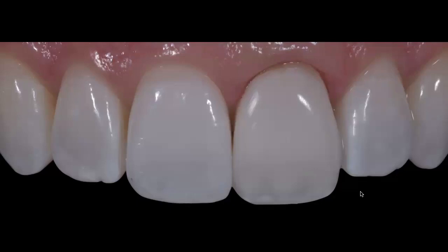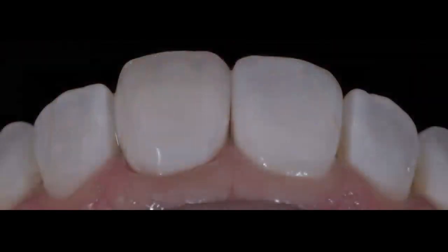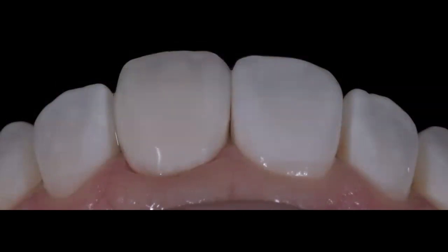This is definitely not the best time for you to evaluate the final color, but you can definitely evaluate the shape of the tooth, the smoothness, the way that we've recreated all the developmental grooves and all the halos and all the effects that we were trying to recreate. They are there. I know that this tooth ended up just blending in with her smile, and this restoration is still in function. I think it's maybe 3 years after it was completed. I've seen some photos of this patient after the restoration. I've seen her smile and it just blended in nicely.